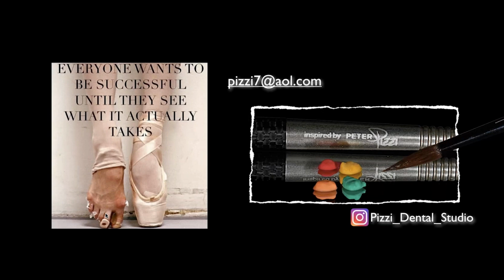I'd rather have too much in the monolithic world, and this way when I come down to the final restoration that's sintered, I can go in with a blue or red or a pink rubber wheel and take some of it out and try to roll those little sharp edges. But I'm really trying to work it through to be perfect in green first, and that's just kind of an endless challenge right now.